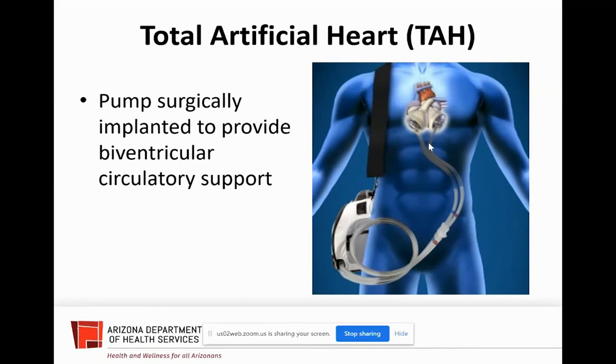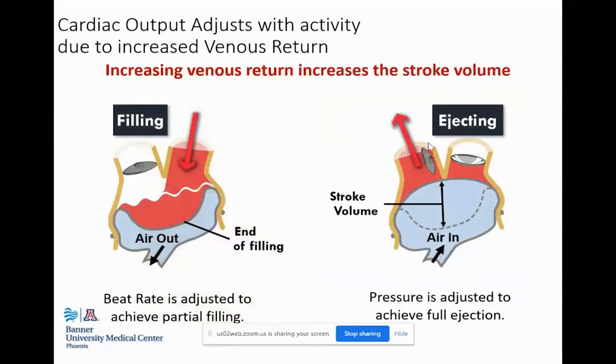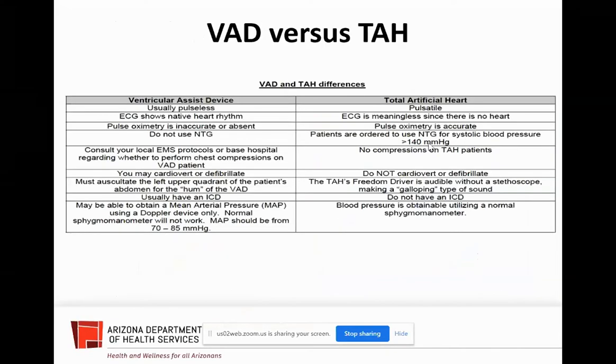They're going to die. No circulation. Yeah. To say it plainly, yes. So if the device stops, their heartbeat stops. Okay. You can consider them asystolic. But because these are big old plastic ventricles, do you think you're going to be able to do chest compressions? Nope. Negative. Correct. So no EKG, no chest compressions, no electrical rhythm, so no defibrillation or cardioversion.